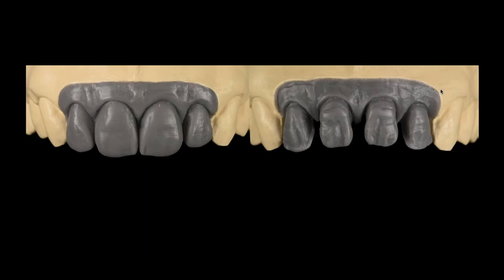And then you're going to notice the cutback. That cutback is designed specifically for this particular course, where I left the laterals as almost monolithic. And I'm going to say almost monolithic in the sense that what they really are is micro layered. I'm just going to layer very small amounts of ceramic on them, and I'm going to leave most of the structure in zirconia. Yet on the two centrals, those are going to be fully layered. And we're going to use whatever we need, 2, 4, 6, 8, 10 powders that we would normally use.